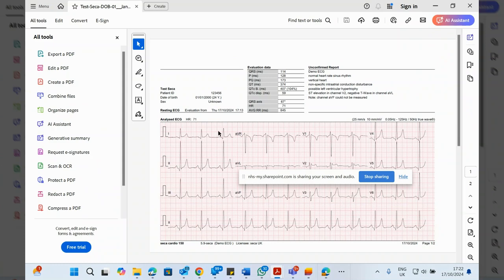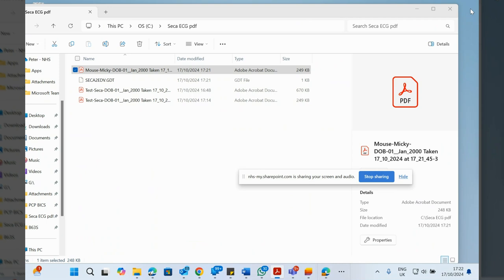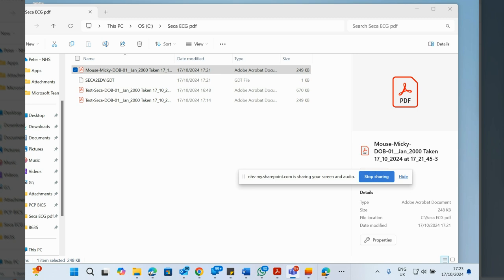Once you're happy, go into Teams, go into the Teams chat that you're in, hit plus, attach file, upload from this device. Go to where your ECGs are being saved, which will be C ECG PDFs. There's our Mickey Mouse. And then all you need to do is hit send, and that will send the ECG in the chat with the doctor.